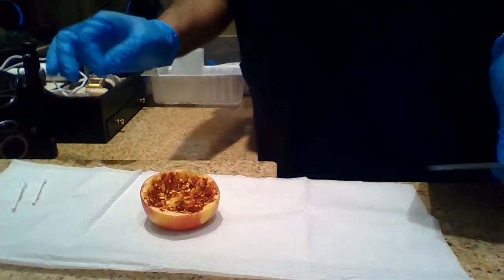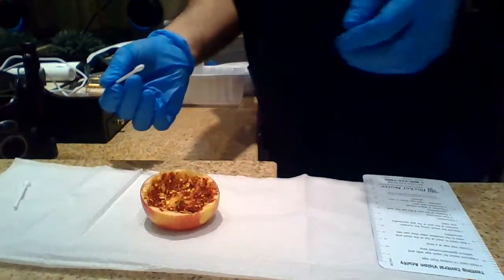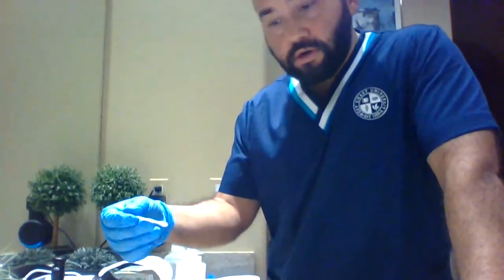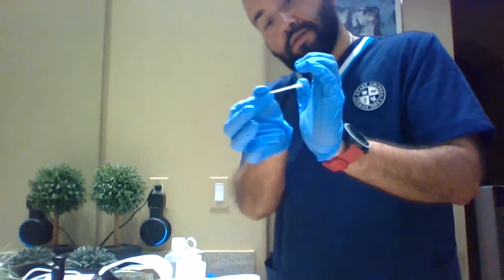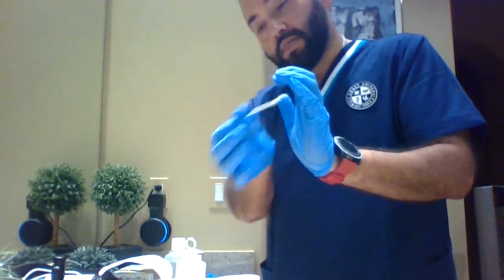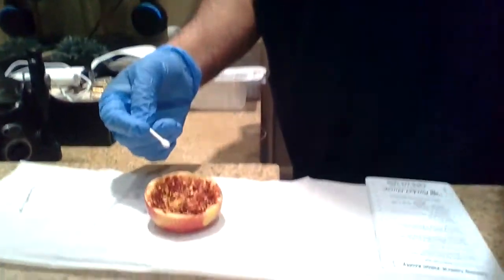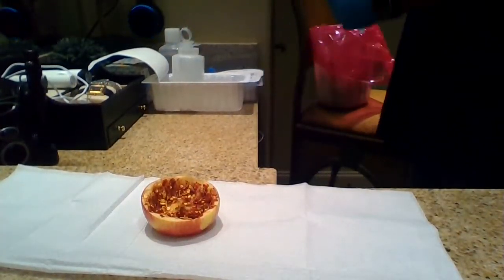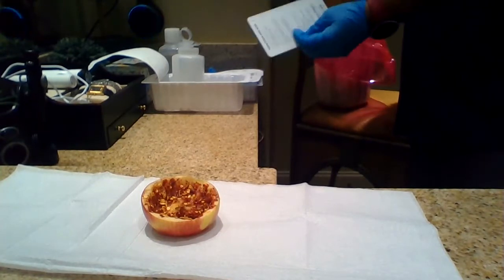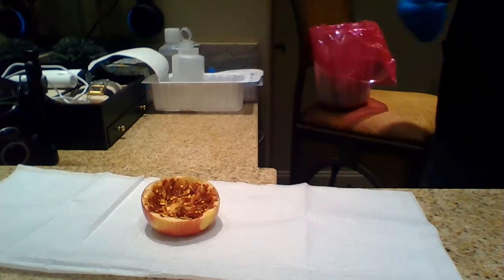There's also something called undermining, which I didn't simulate here, but undermining is when there's tunneling, or it's going underneath the skin. So if this was a skin overlapping, you could actually go in there, or again, if it's tunneling and actually going somewhere else. So now that we have all the measurements and we have them written down, we dispose of everything. Everything goes right in the bag, which this I'm not going to dispose of because it's still good. But normally in any situation, we dispose of this too.